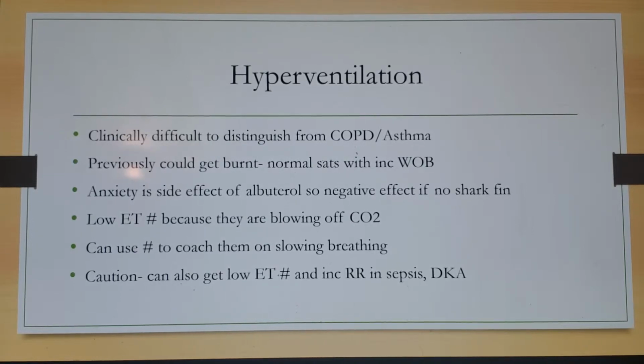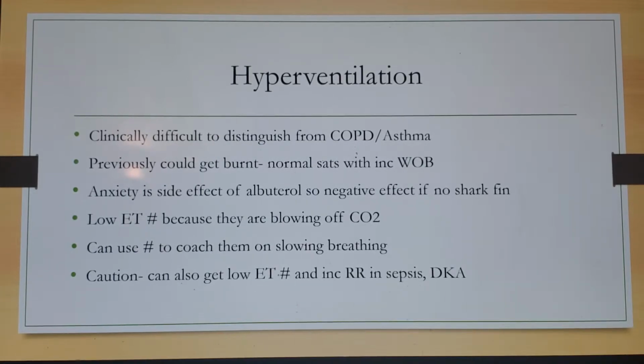Just remember there's a low end tidal CO2 because they're rapidly blowing off CO2. And you can use that number to coach them on slowing their breathing down. So if their end tidal is very low, you can say, slow down, have them breathe in a bag, or the old non-rebreather at 2 or 3 liters a minute trick for that as well.